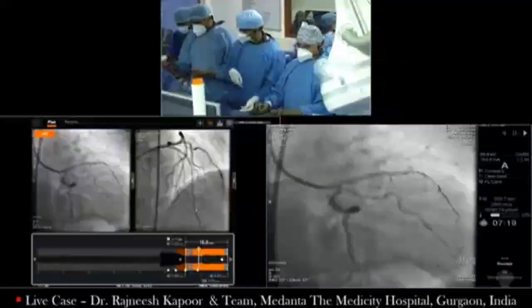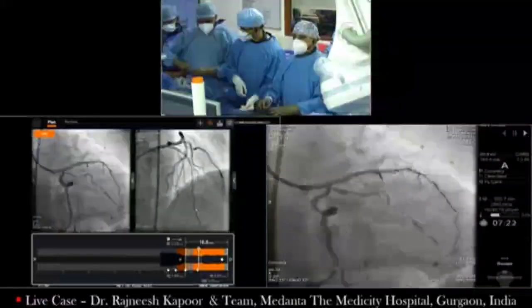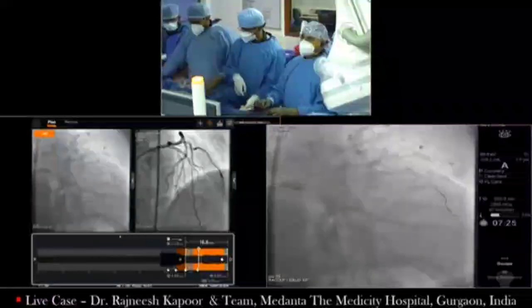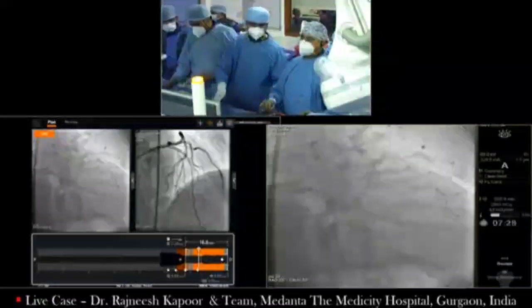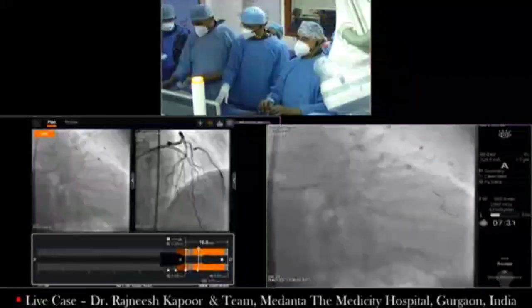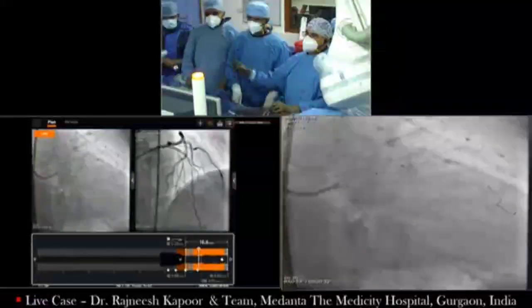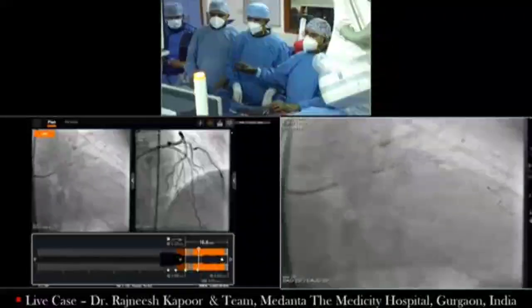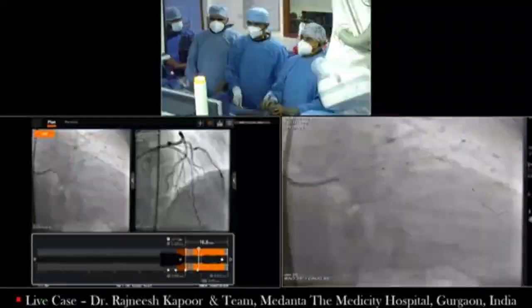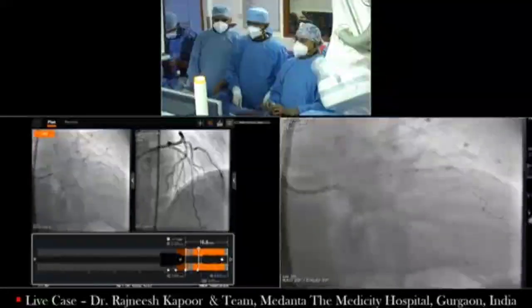So this is almost our second, third case of non-crossable with orbital. I mean, as dictum, it's rota, but somehow we got stranded in one more patient like this where it was non-crossable. With the ablation again backwards as well. There are other advantages. There is no slow flow with orbital, I mean very less, and then TPI is not required. So slow flow with the rota is much more.